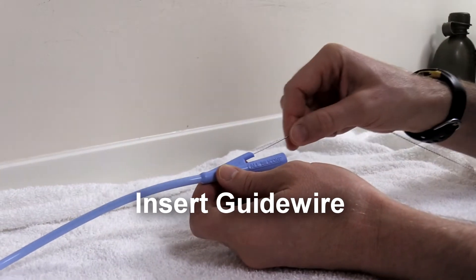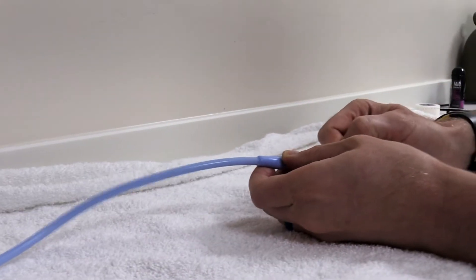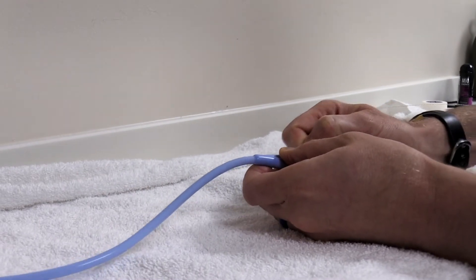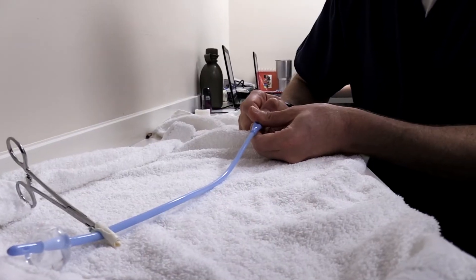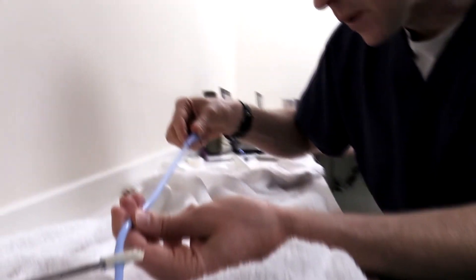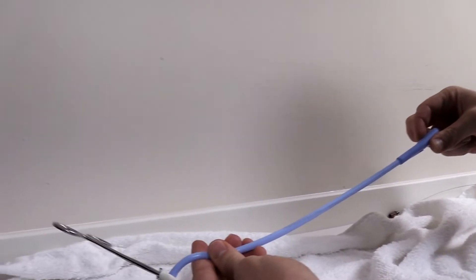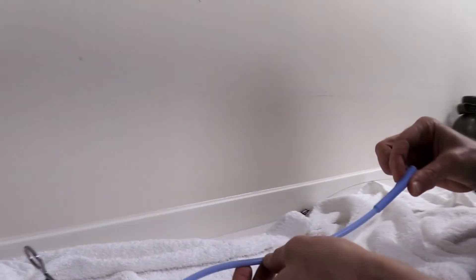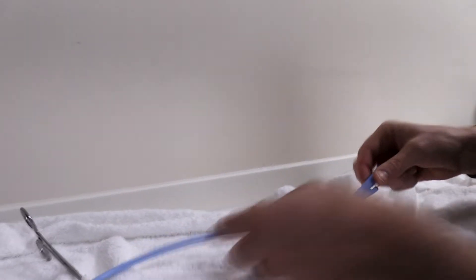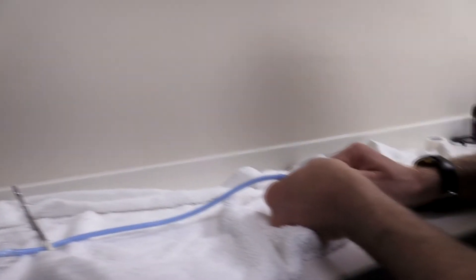The next step would be to take a guide wire. I took this guide wire from a small feeding tube, and we're going to advance that guide wire. It is a tight fit but it is advancing. In general, you're supposed to use central line guide wires — this one from the feeding tube is a woven wire so it's a bit thicker.